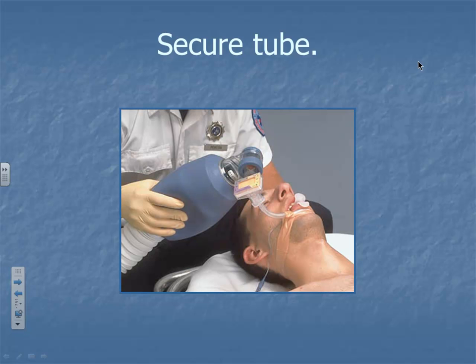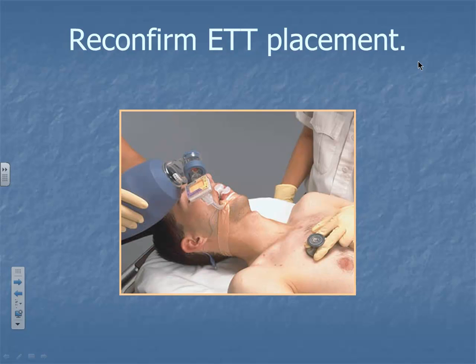Okay. All right, guys, let's get started. Okay, and the last thing was to secure the tube, right? And after that is you're going to reconfirm tube placement. Now, this is extremely important. Right now, you want to reconfirm and make sure you've got tube placement.